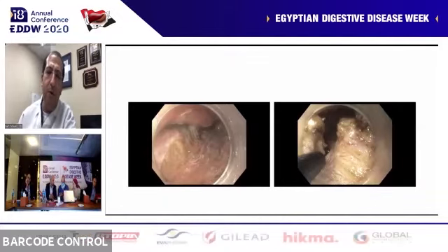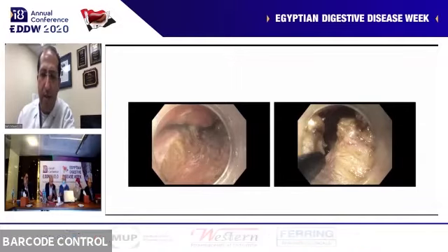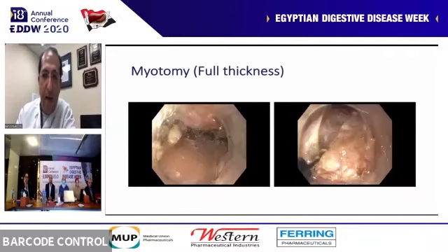We also don't have a lot of data about recurrence of achalasia or failure of POEM. POEM has been around for only about 5 to 7 years in large, multi-center trials. But people prefer full thickness myotomy. It worked just as well as the circular muscle myotomy.